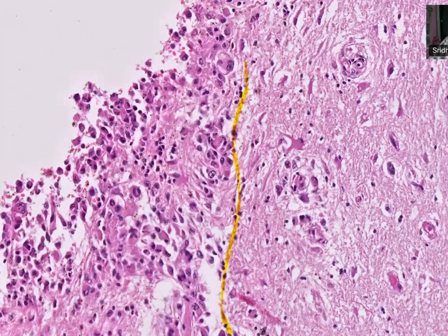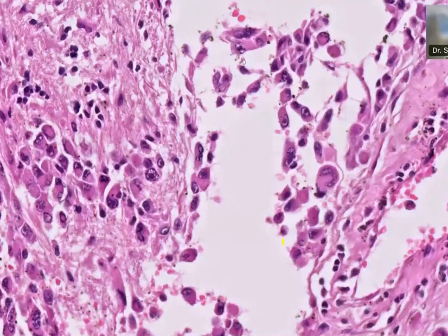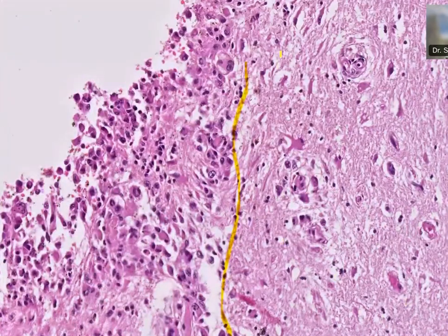Whenever you have any high grade tumor, you avoid using the phrase circumscribed astrocytic glioma. As long as the tumor is lower grade, the diffuse and circumscribed distinction comes. Many of these high grade tumors can be circumscribed on histology and even radiologically. Chair, are you asking something? I wanted to ask, the stroma on the right side, is this necrotic? No, sir, this is normal native parenchyma.